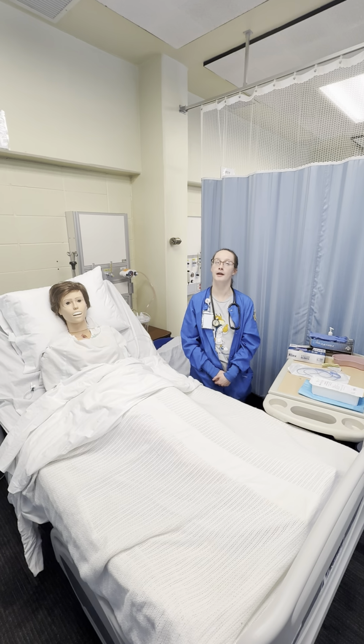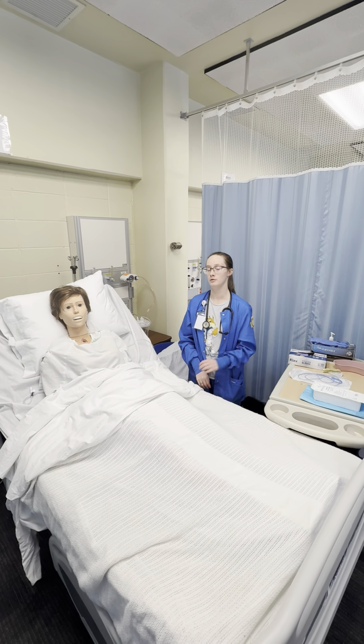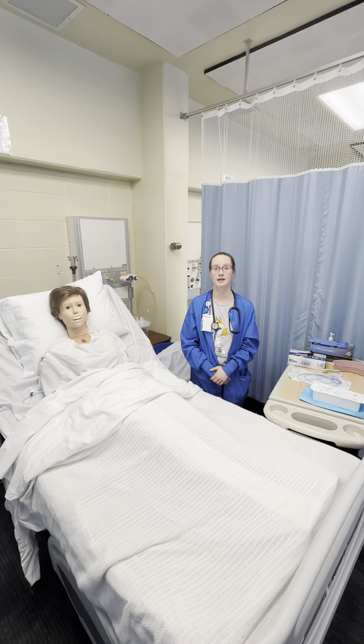Then I would go ahead to the patient's room, knock and introduce myself. I'm going to provide privacy and explain the procedure to the patient, why we are doing it, the reasoning, and any possible discomfort that they may experience during the procedure. Then I'm going to identify my patient using my 2 patient identifiers. I'm going to ask for their first and last name, date of birth, and match it to their wristband.